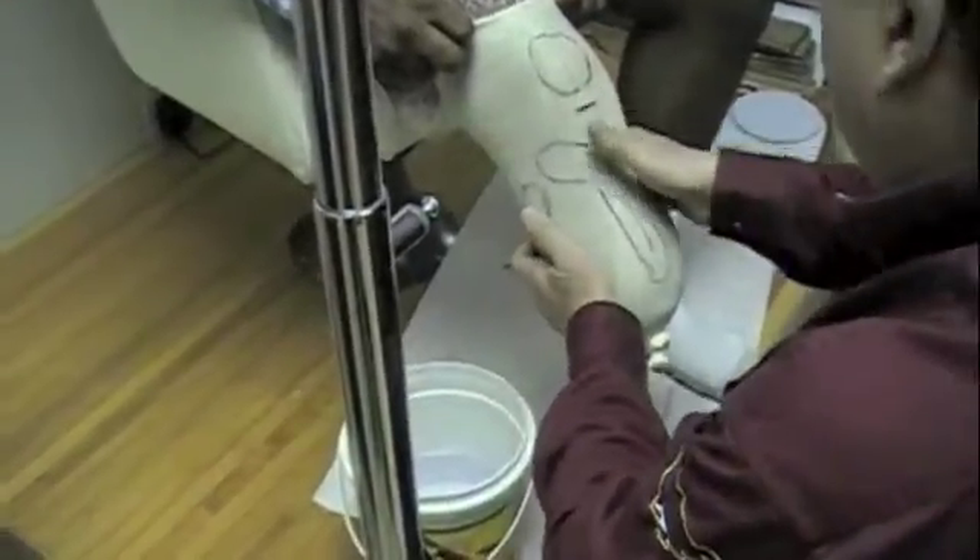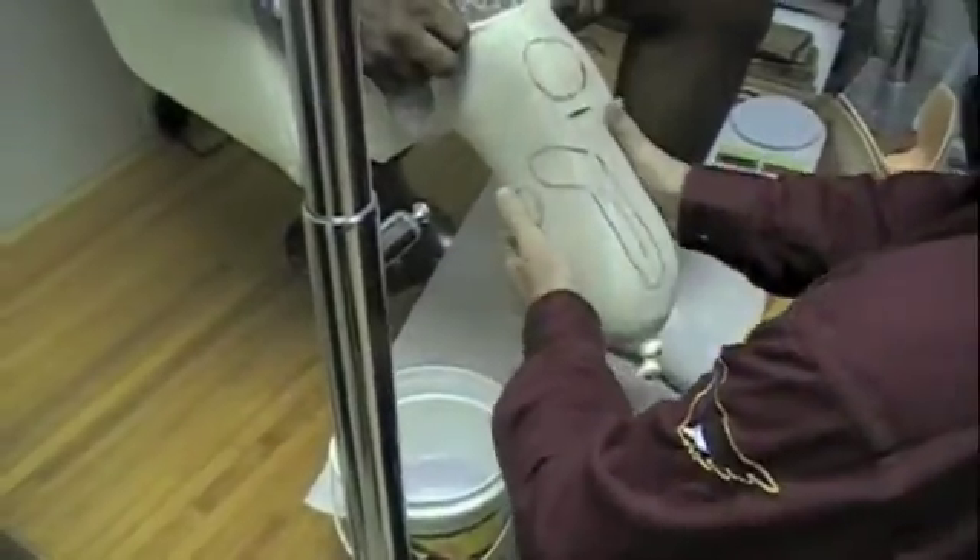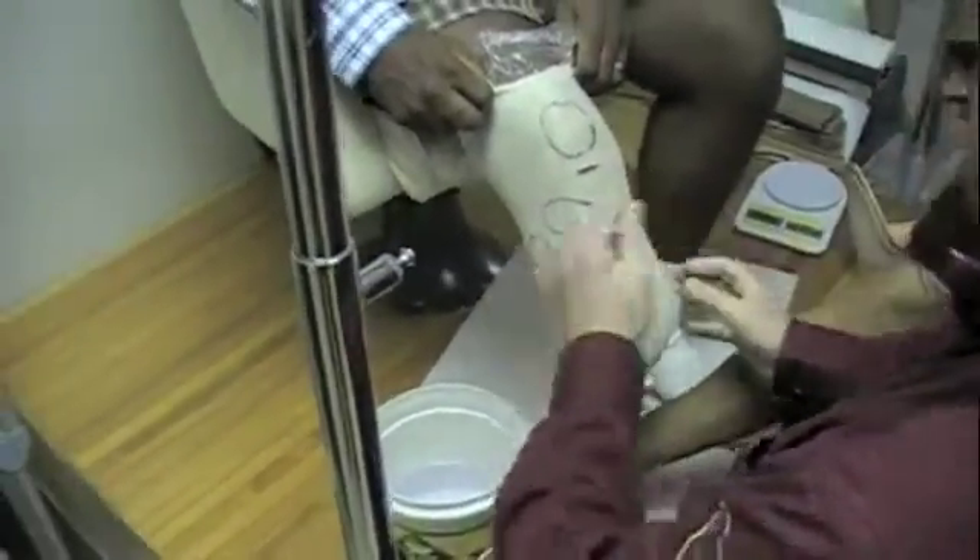We'll also mark underneath the medial flare, right in here — the medial's inside — because that's an area that can tolerate a lot of pressure. You can take a lot of weight there, so I mark it.